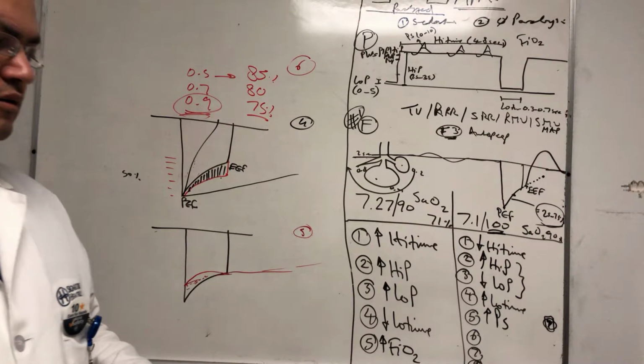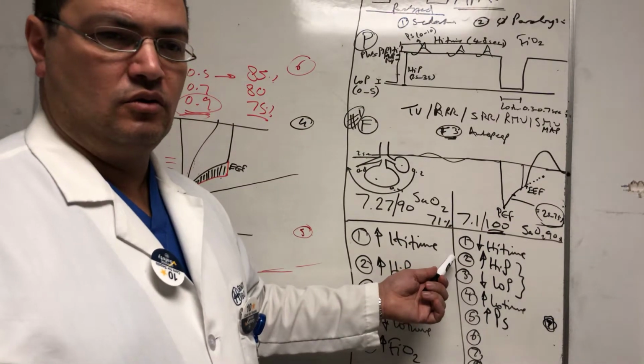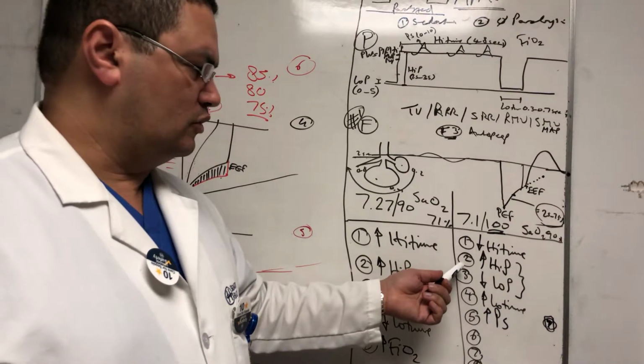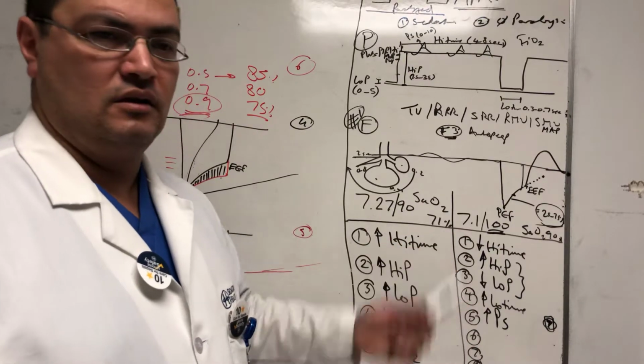The other reason that we don't do pressure support is the high pressure. We typically don't like to give patients more than 35 maximum airway pressure, right? So if you already went through the algorithm and raised the high pressure to 35, if you add anything else, that's going to be above that.